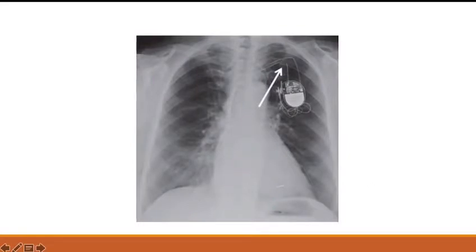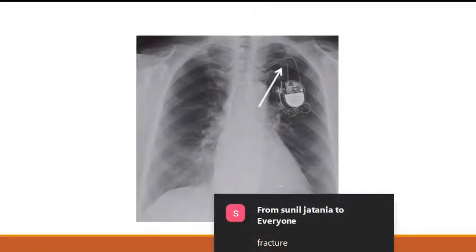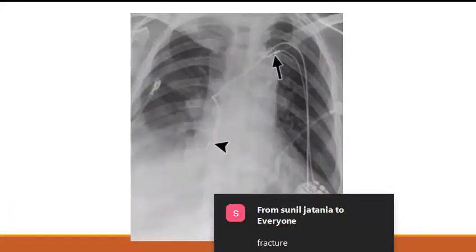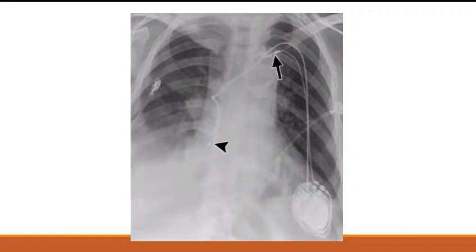There is a fracture of the pacemaker lead. Also, the pacemaker has been displaced — the lead has gone from the thoracic cavity into the abdominal cavity. The atrial lead should have been here and the ventricular lead should be here — this is displacement of the leads.